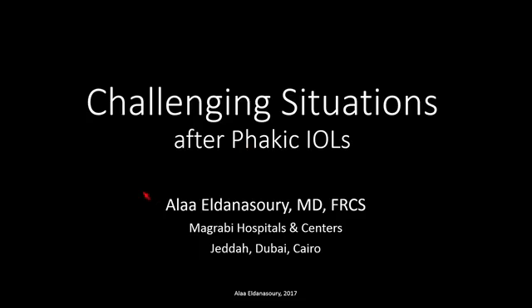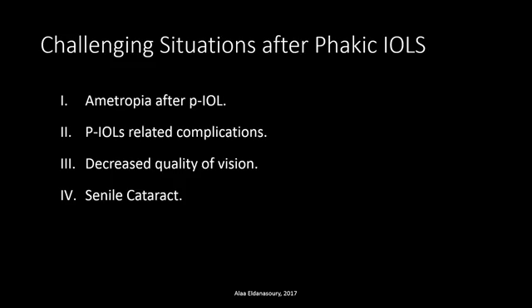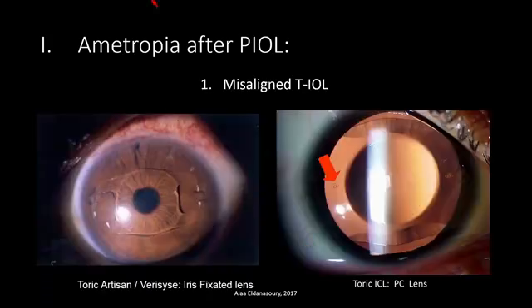I was asked to put together some challenging situations with Phakic intraocular lenses. These are my financial disclosures. So I put them in 4 groups, and we're going to go through them one by one. Maybe the more common, but the easiest to treat, is to have ametropia after Phakic IOLs.